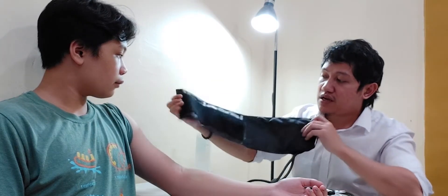I think you've been wondering about the parts of this sphygmomanometer and stethoscope — these are the only tools I'll be using to measure your blood pressure. We call this the sphygmomanometer; the entirety of this cloth is the cuff, while this part is the inflatable bladder. Attached to it are two tubes: one tube is attached to the manometer or dial, and the other tube is attached to the bulb, which is controlled by the valve for inflation and deflation. To listen for the Korotkoff sounds during measuring of your blood pressure, I will be needing the stethoscope, which includes the earpiece, a tube, a diaphragm, and the bell. The bell is the smaller part and the diaphragm is the larger.